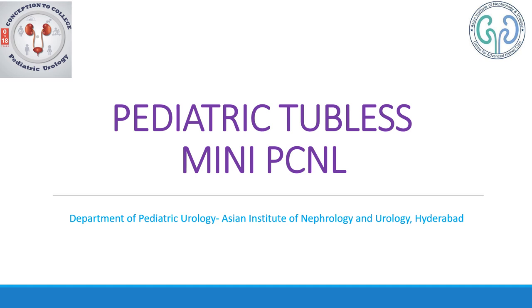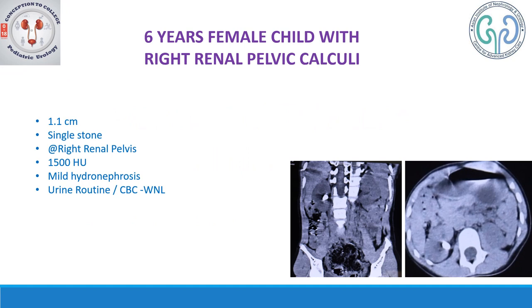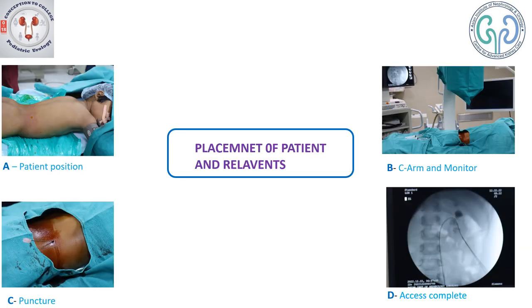Here we see how a pediatric mini PCNL is done. This is a six-year-old female child with a right renal pelvic calculus of size 1.1 centimeters — a single stone with Hounsfield units of 1500. She also had mild hydronephrosis because of the stone. Investigations like urine routine and CBC were within normal limits. Here is a CT showing the calculus, and you can see the same in the axial section.